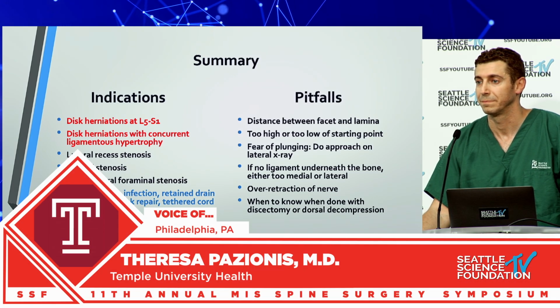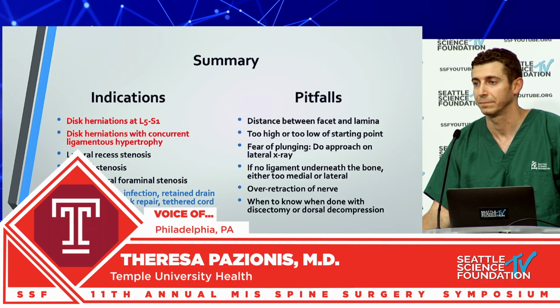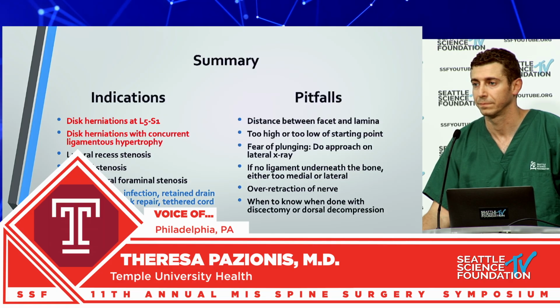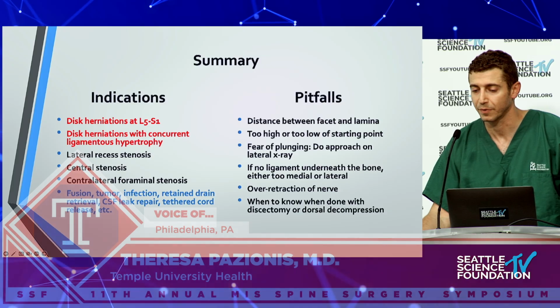Question about incidental durotomies. Can you use a durostat through this approach? And what is your workflow if you do get a durotomy? Is it that you convert to open? Do you fix it endoscopically? And how real is the risk of intradural compartment syndrome with the fluid?